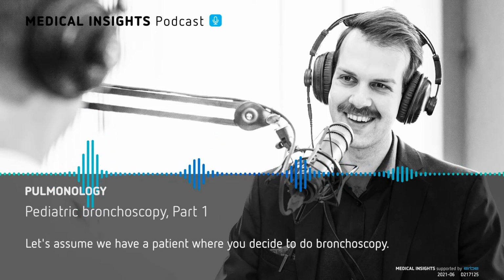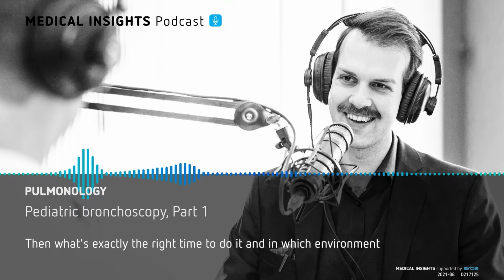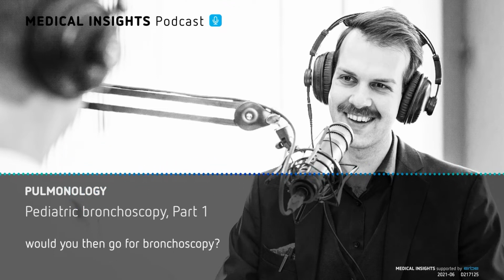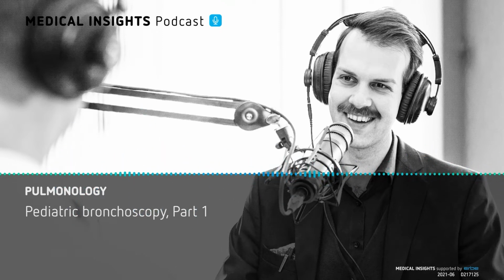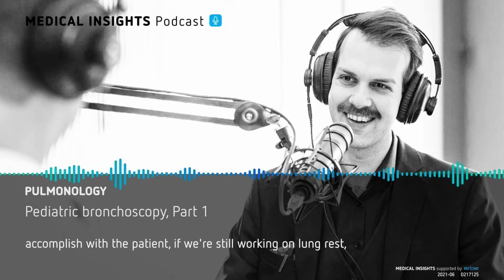Let's assume we have a patient where you decide to do bronchoscopy. Then what's exactly the right time to do it, and in which environment would you then go for bronchoscopy? Well, the timing, I think, depends on the disease process. Also, what we're trying to accomplish with the patient.